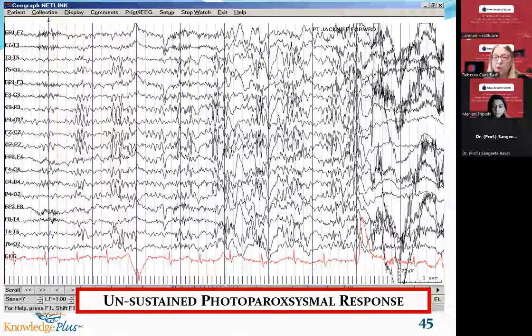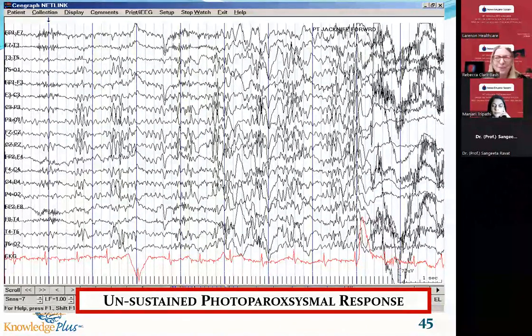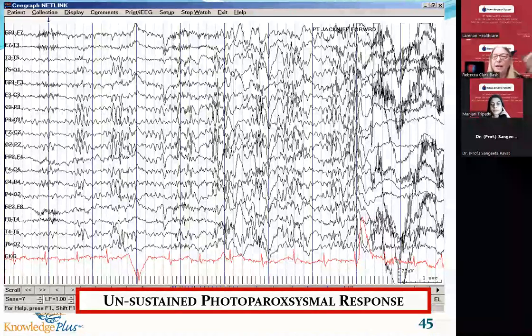So he is in this chair. I am teaching at that hospital. It is day one, and they have never done an EEG. Everything's new to them. The director came in and said, we have a patient coming from the prison today. Could you do him? I'm like, no, they don't even know the 10-20 system yet. Of course not. We can't do him. He said, well, I'm going to call our per diem, our on-call tech. And I said, fine, can we watch? That'll be a good experience.